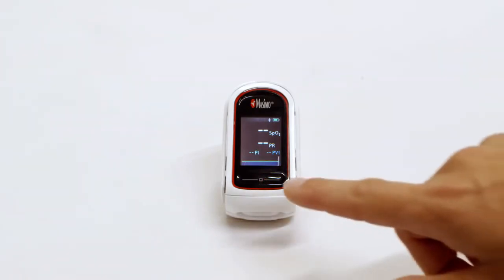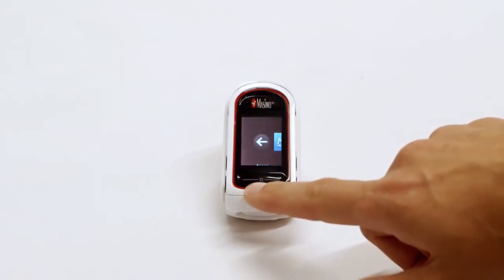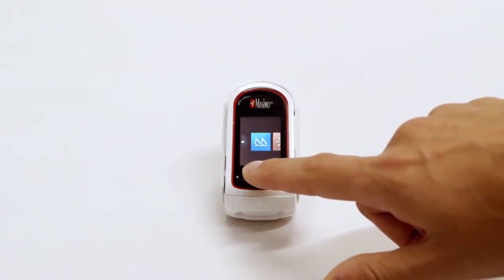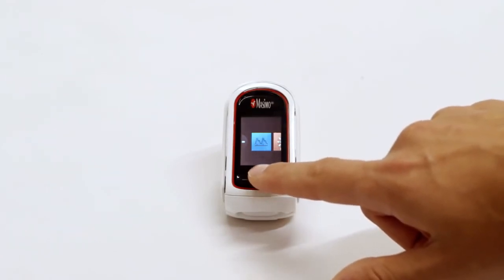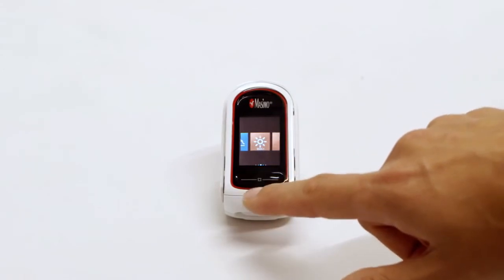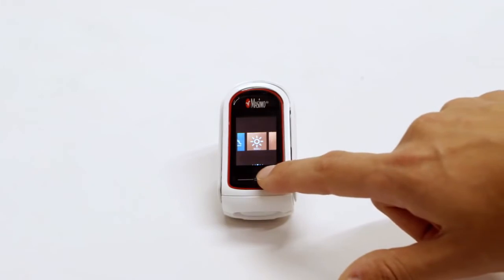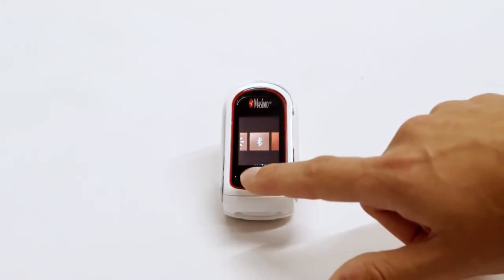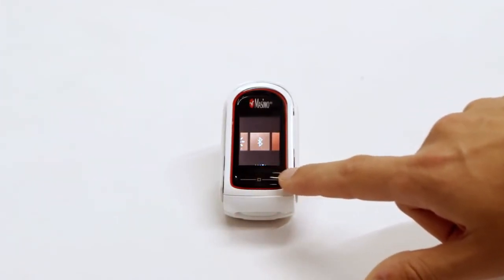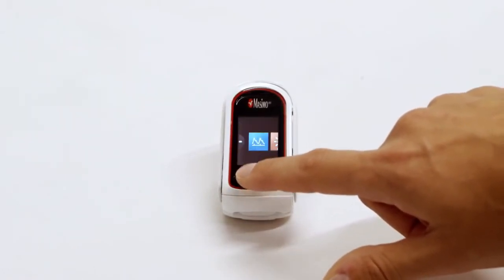To access the main menu, press and hold the touchpad until the menu appears. From this menu, the user can enable or disable the waveform on the screen, increase or decrease the brightness, activate or deactivate Bluetooth, or find hardware and software information about the device.